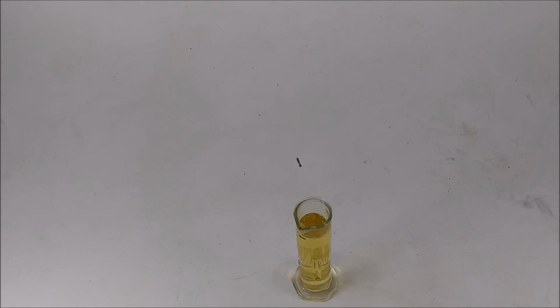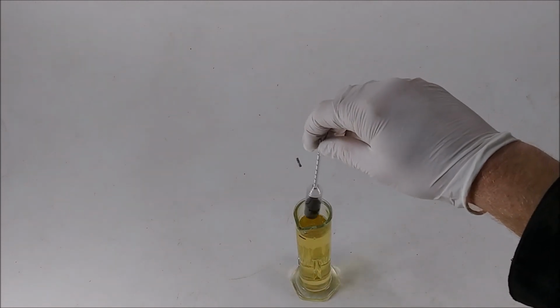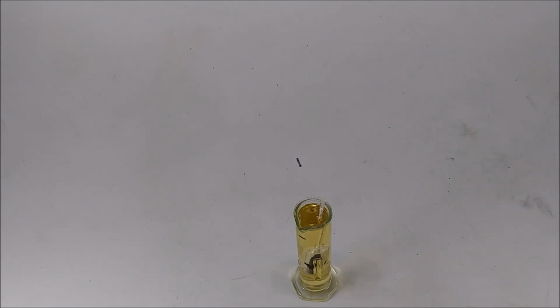You want to carefully put the float in, and when you do, you want to impart a gentle spin on it so that it is suspended evenly and doesn't cling to the side. Shortly I'll bring the camera down to a closer shot so we can really read the meniscus on that.